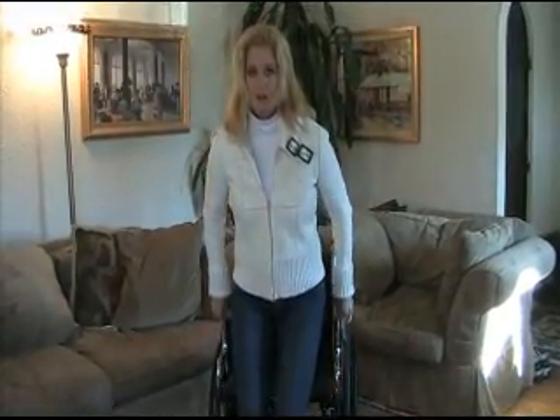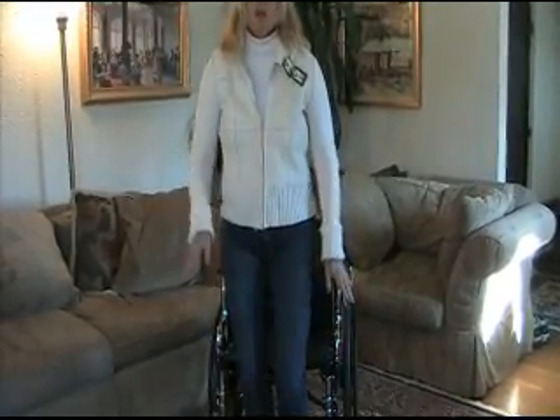This wheelchair — when your loved one stands up, now watch this — it locks, and what that gives you is peace of mind. Now Teresa is going to tell you all about this wonderful wheelchair.